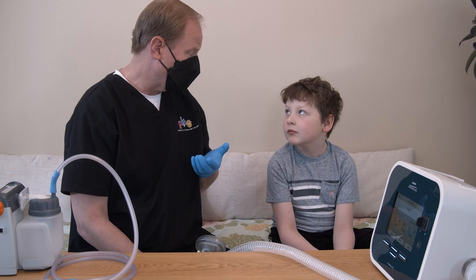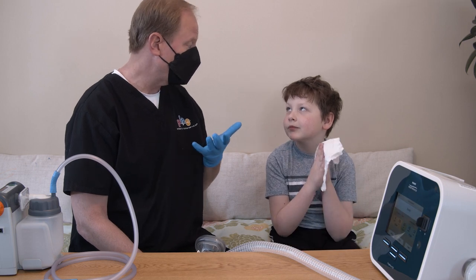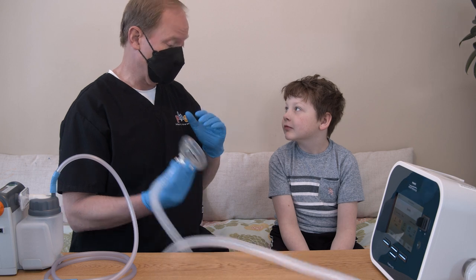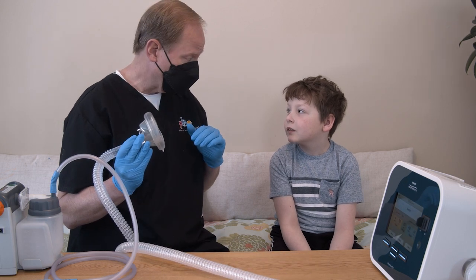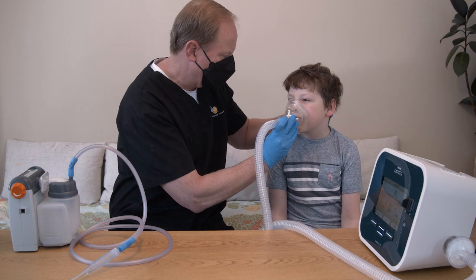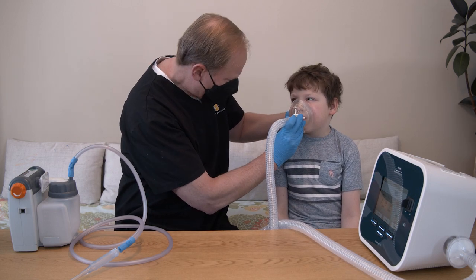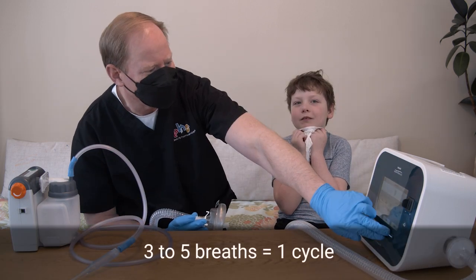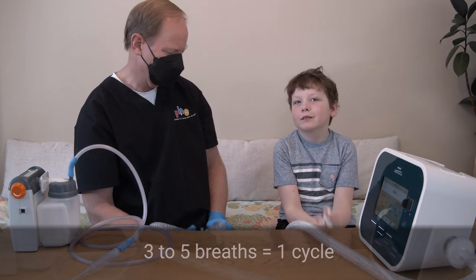If your child is able, ask them to hold their breath as long as it is comfortable between each breath, and when they exhale, ask them to use the air to cough. Push the therapy or start button to start the session. Allow the device to give the prescribed number of breaths, usually 3 to 5 breaths in a row — this is one cycle. Press the standby or pause button at the end of the cycle.